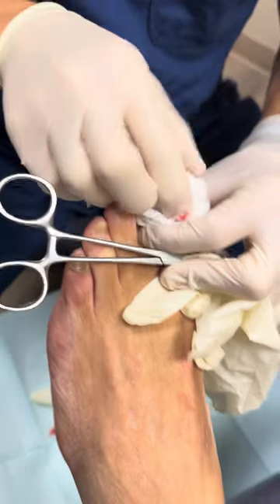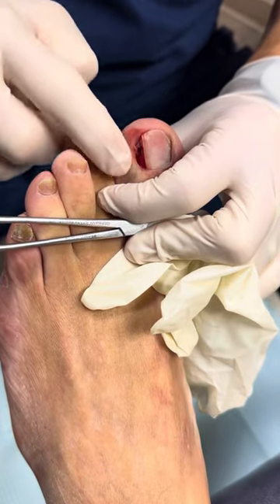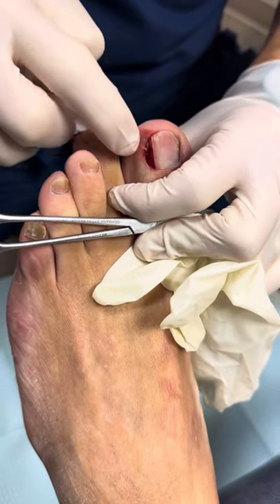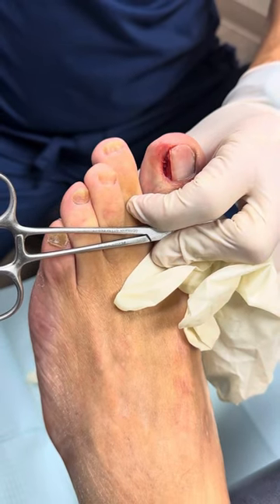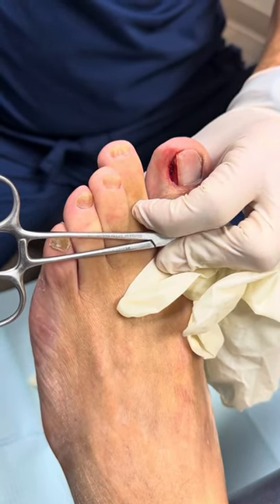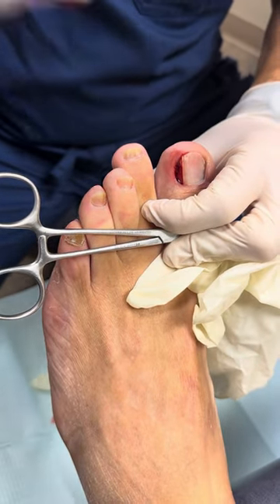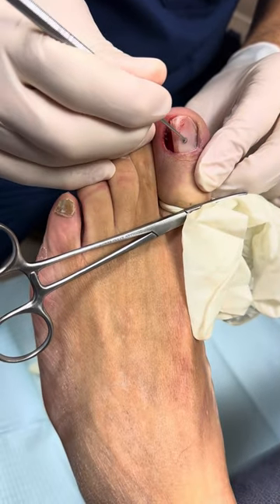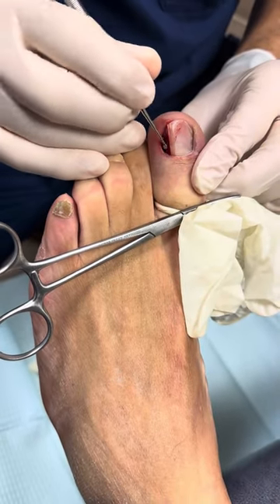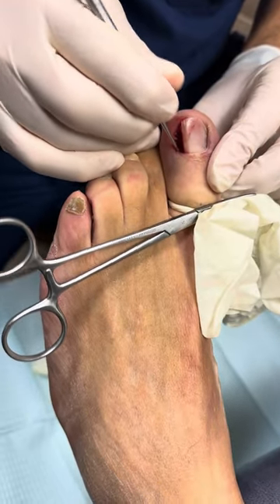We're going to dry this out a little bit. That space underneath the nail is the nail bed — the nail bed is just skin. I'm going to take an instrument called a curette, using all sterile instrumentation here, and we're going to use the curette to scrape the nail matrix. The nail matrix is that little white tissue under your nail — those are the living nail cells — and we're going to scrape those nail cells.